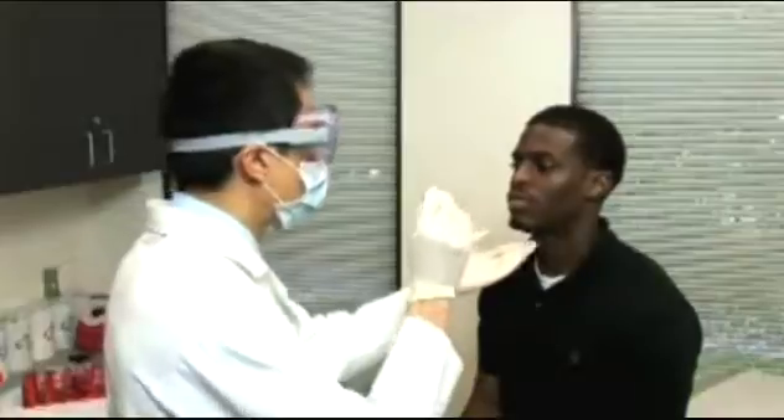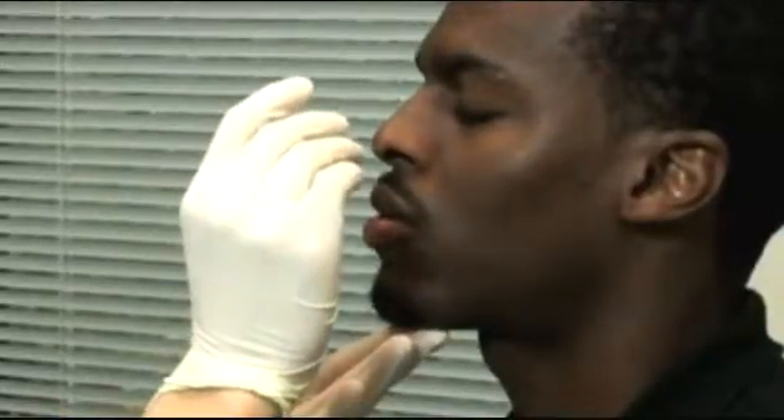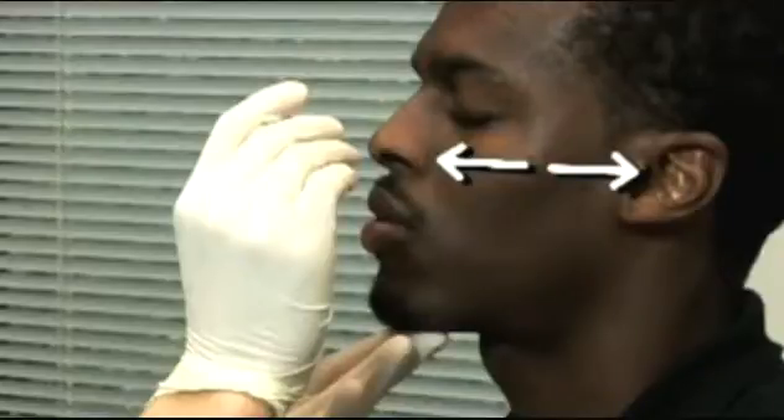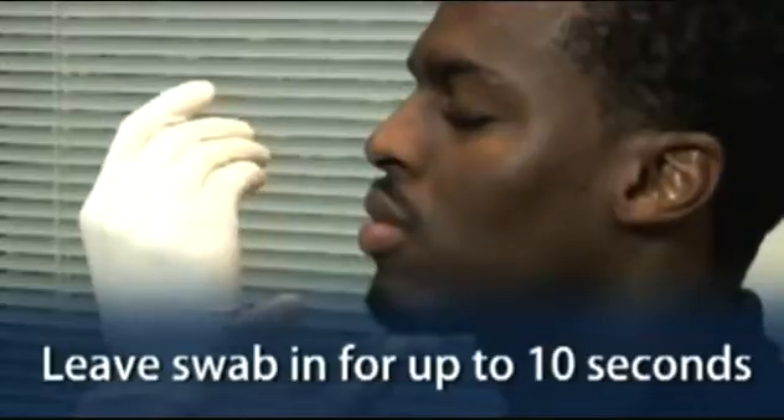Gently insert the swab straight back into a nostril, aiming posteriorly along the floor of the nasal cavity until reaching the posterior wall of the nasopharynx, being careful not to insert it upwards. The distance from the nose to the ear gives an estimate of how far the swab should be inserted. Do not force the swab — if an obstruction is encountered, try the other nostril. Leave the swab in place for up to 10 seconds and then remove slowly.